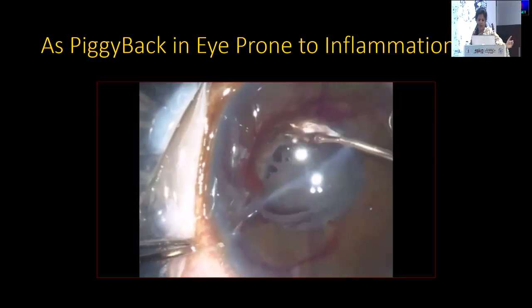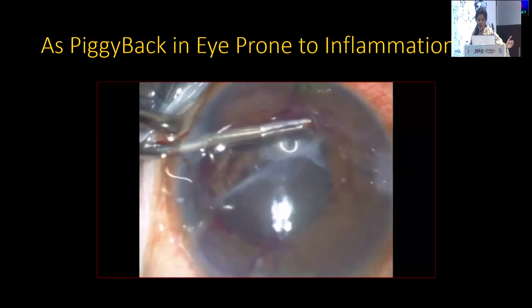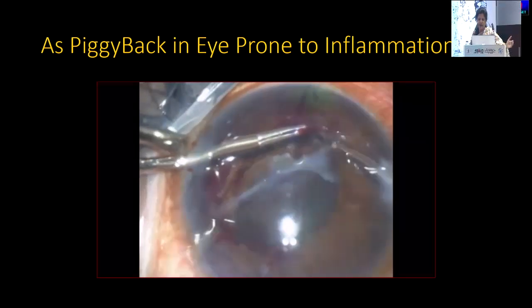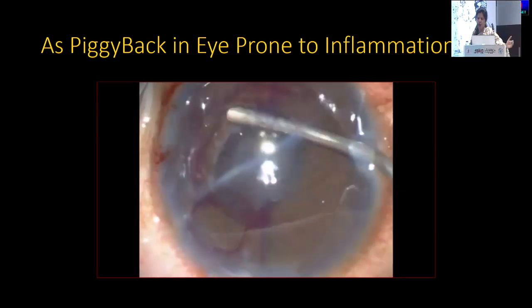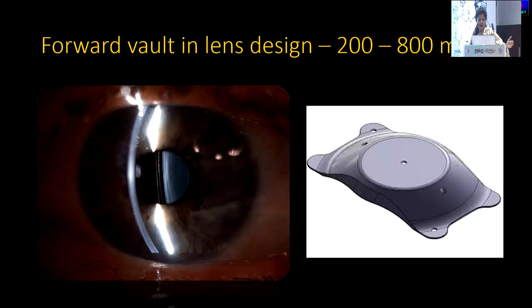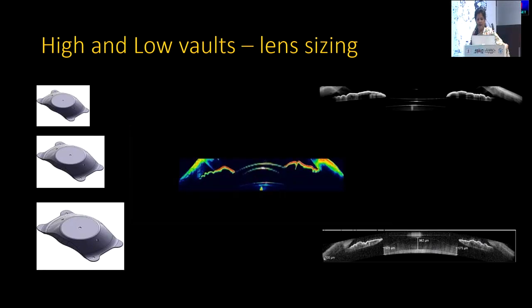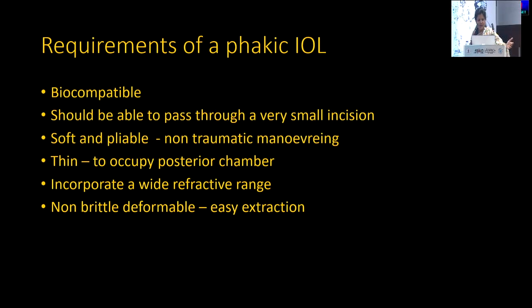Now this is a post-trauma eye with a high refractive error and a PCIOL in place. So the high refractive error can be corrected by keeping the ICL over the IOL. Just be sure that there's no residue in the interface. Then again, vaulting, I think, will be talked about during the complications. So these are how you divide between laser vision correction and phakic IOL.